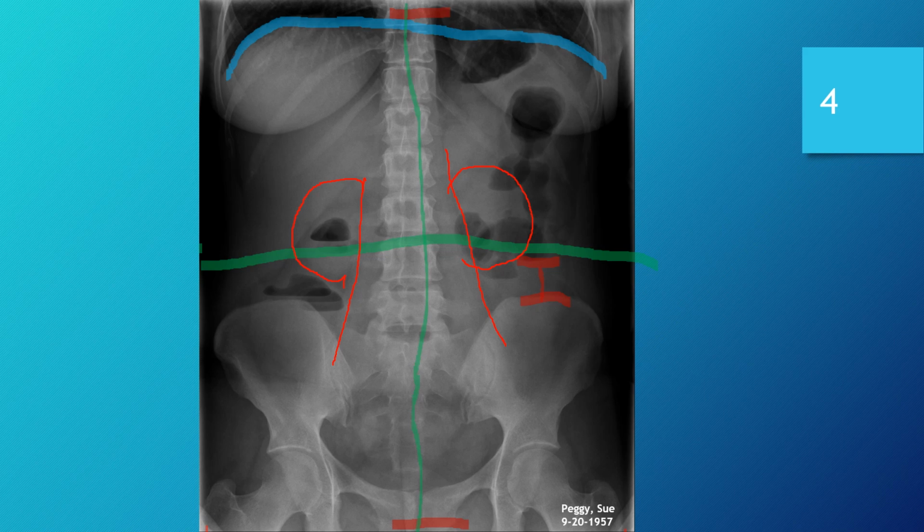Just a cautionary note, as you can see, the patient's hands especially have a tendency to work their way into images. So absolutely always make sure you know where your patient's hands are before you make an exposure, because I promise they're not even going to think about it. They're going to move their hand right back into the field of view. And so you just have to really hammer that specification in when you're doing your exams, that they cannot move their hands, because as you can see, it doesn't take much before they creep into your picture.